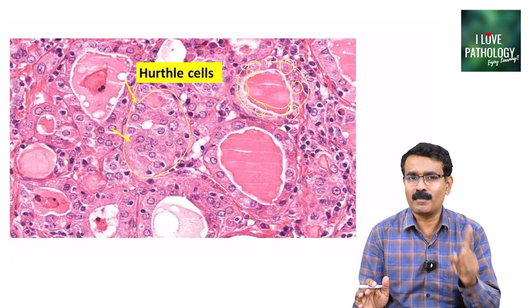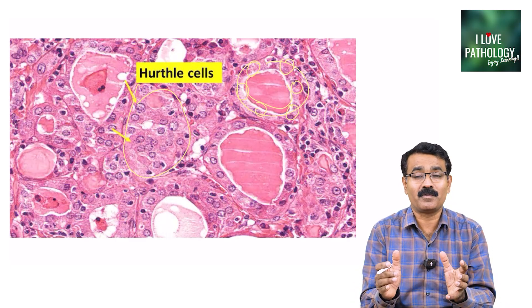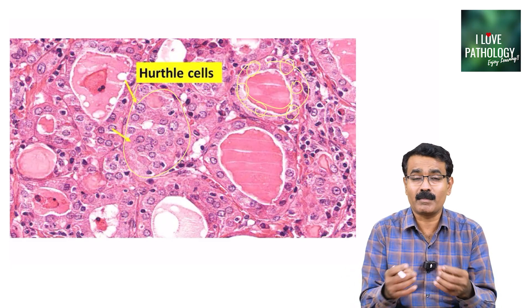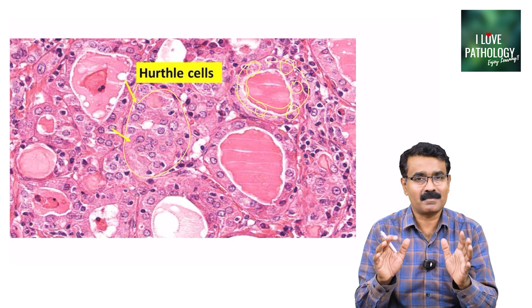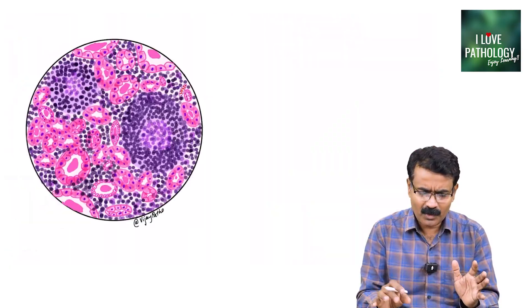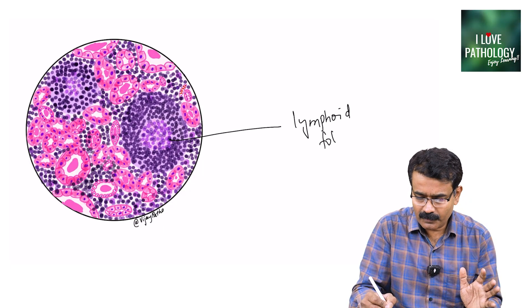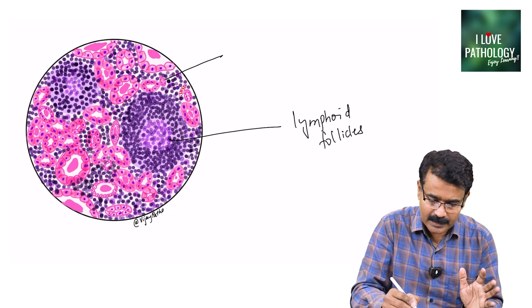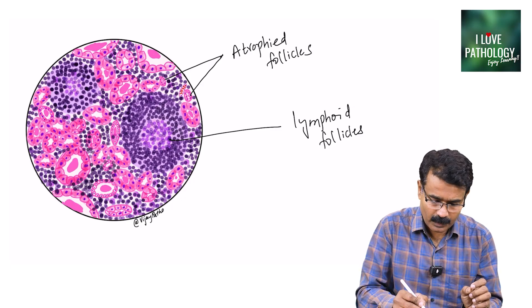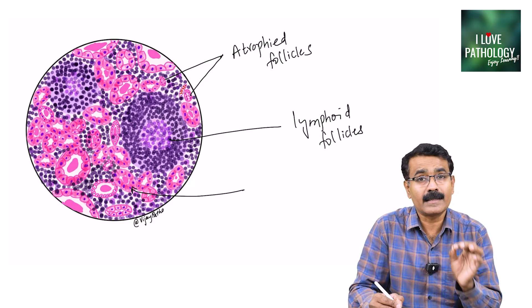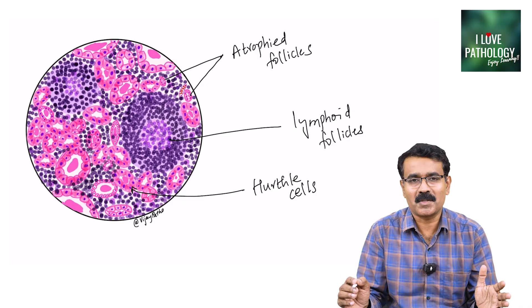In Hashimoto's thyroiditis — an autoimmune disease — you should demonstrate lymphocytes, plasma cells, and lymphoid follicles, as well as the thyroid follicular epithelium showing degenerative changes in the form of Hurthle cells. Follicles can be atrophied with variable degrees of atrophy and dilatation. To write up Hashimoto's thyroiditis, identify lymphoid follicles with prominent germinal centers, atrophied follicles, and thyroid follicles showing Hurthle cell change. If you can depict all three findings, that covers Hashimoto's thyroiditis.